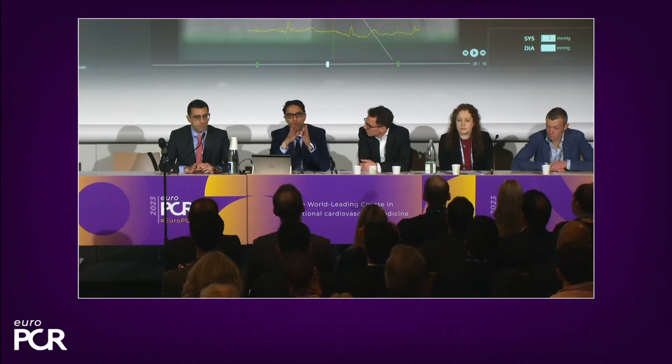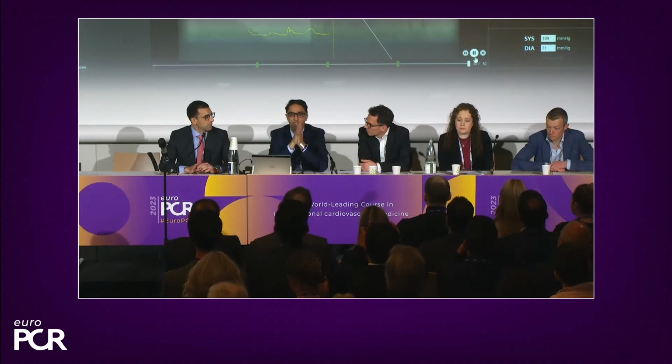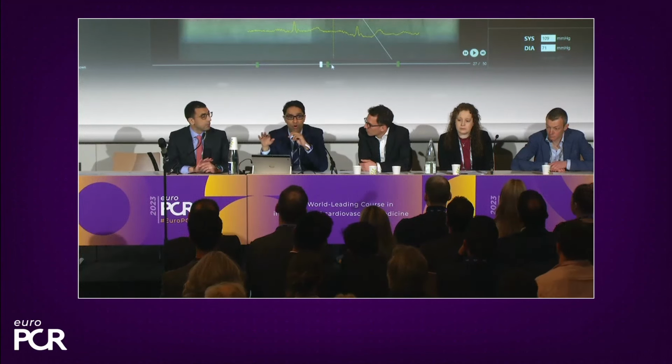There are two ways to basically get the DICOM images that I'm aware of. Please, panel, chime in. One is to use a DICOM node. That is, the X-ray system directly pushes the X-ray images, either the ones that you select or all of them, directly to the Angio-FFR system. That's the fastest way. The second way, which is a little bit more of a turnaround, is that your DICOM goes to your PACS. After you've got all your angiograms into the PACS, you can then push them from your PACS directly into the Angio-FFR system.